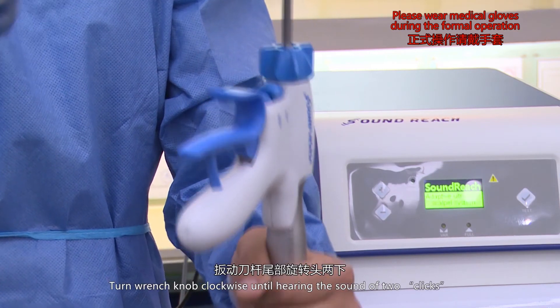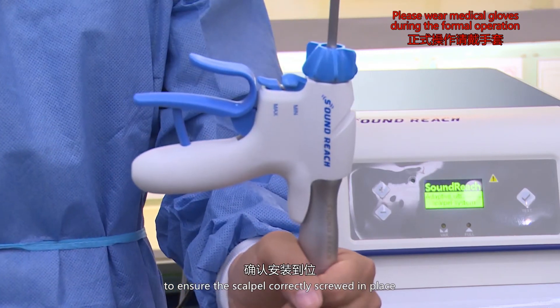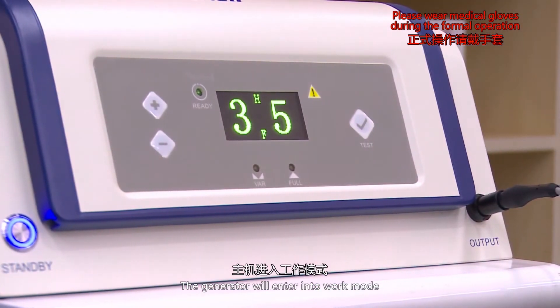Turn the wrench knob clockwise until hearing the sound of two clicks to ensure the scalpel is correctly screwed in place. After assembly is finished, press the standby button. The generator will enter into work mode.